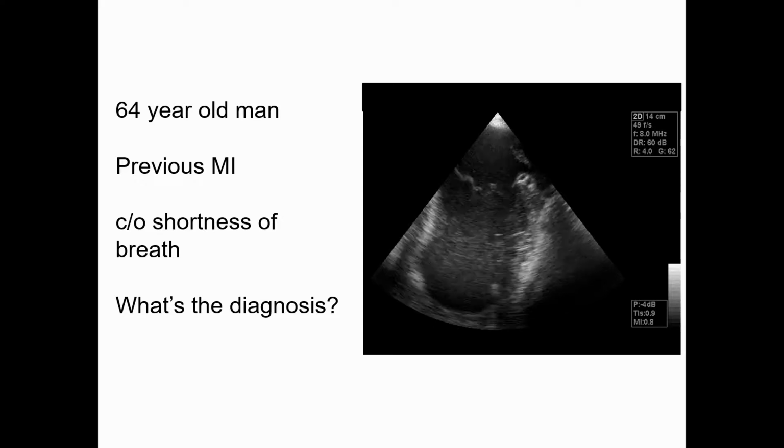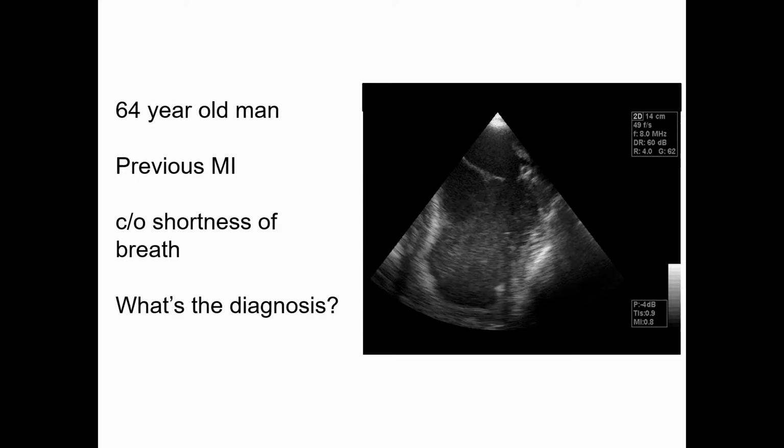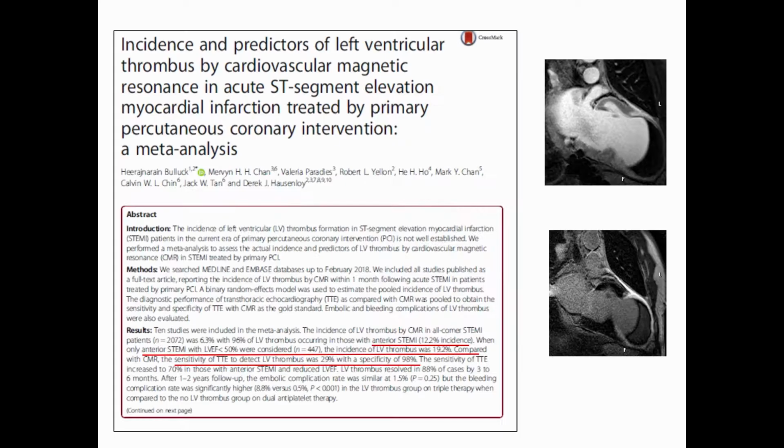Look. Yeah, apical aneurysm, it's dyskinetic, it's bulging outwards here, isn't it? Okay, so the diagnosis is massive apical LV thrombus. So what you were seeing there was the thrombus, you weren't seeing the apex at all, and that can be quite tricky to image the apex sometimes, particularly if it's very aneurysmal. So here you can see that's the same patient, the MRI scan, a little bit of contrast, the thrombus is black, the infarct is white around the myocardium with this darker thrombus in the middle.